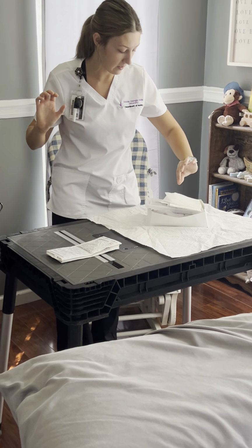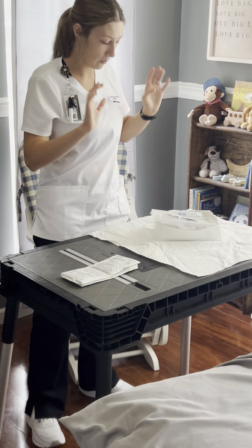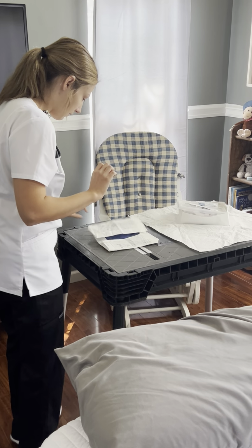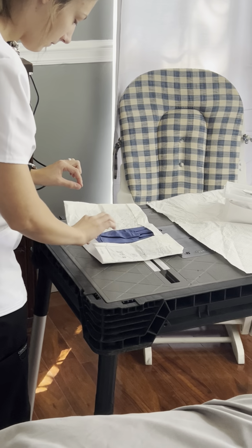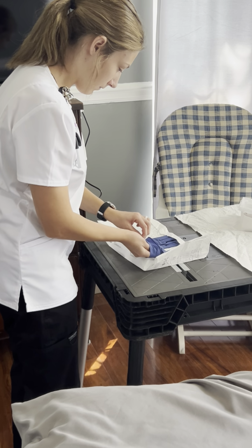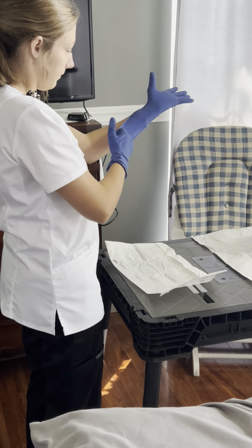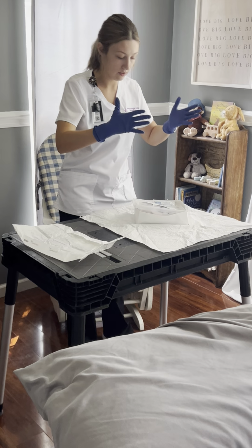So I'm going to remove the secondary mat, and I'm going to stop right there because everything is sterile, so I'm going to don sterile gloves. Now I can square my box.